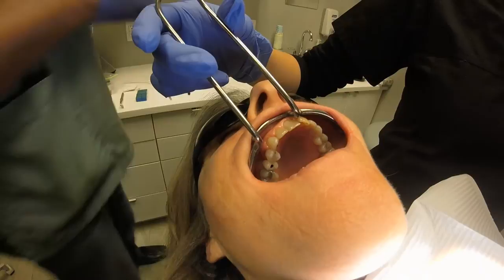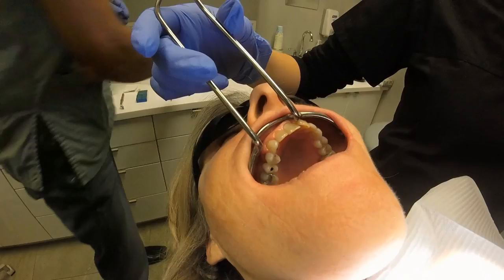In this video, you can see that we're inserting the screw retained crown. I have my assistant retracting while I'm using a 1.25 millimeter hex wrench and placing this with the piece of shim stock in place. You can now torque this into place. In this particular case, this is an AstroTech implant. We're using the torque wrenches provided with the AstroTech implants, and they recommend that you torque these down to 25 Newton centimeters. The way this torque wrench works is you twist it till it breaks at the appropriate torque level. You can see that right here.